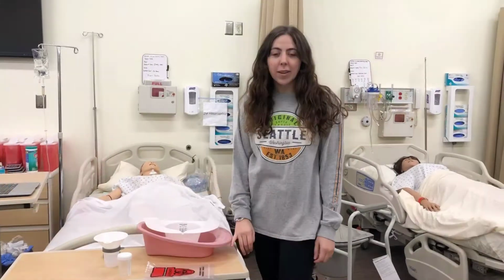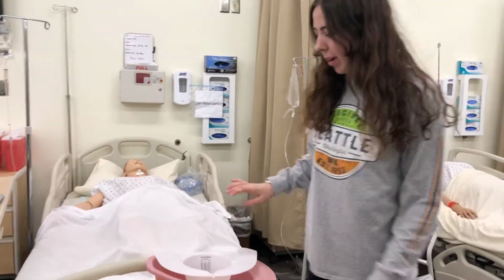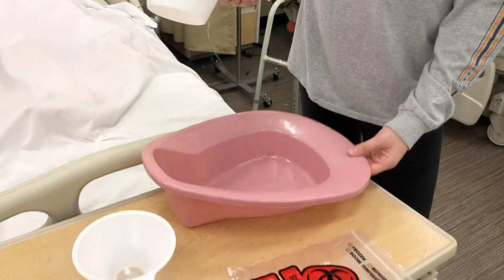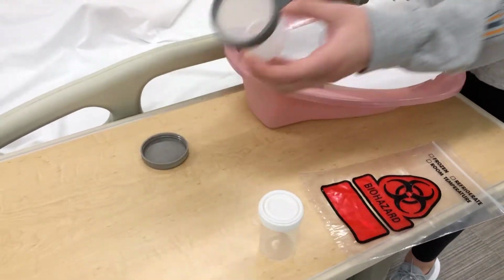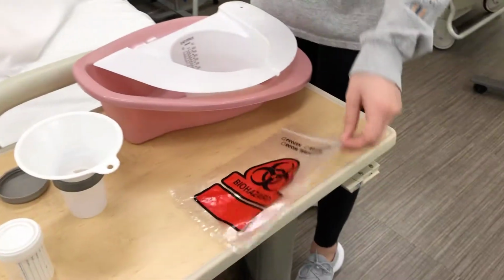That's all. So today I'm going to be talking about collecting urine and straining it for kidney stones. I'll have all my supplies here. You would use a urine hat if they are mobile, a bedpan if they're not. I have a urine specimen cup, a funnel, another specimen container, and a biohazard bag.